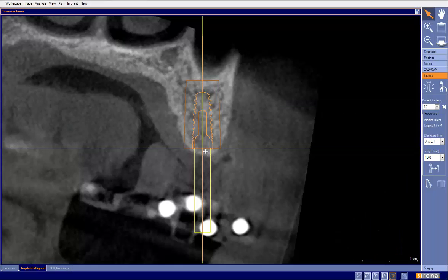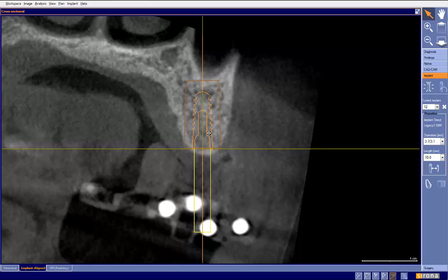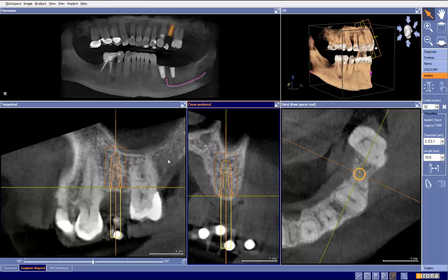Now the next thing is our bone level, and again a rounded bone. Maybe we could drop that to right there, but if you compare that to that, it's not that big of a deal. I would say bone-wise, this is fantastic from a bone level perspective. Vital structures, we do have to worry about the sinus here. Based on these images, we look to be avoiding the sinus. Now, remember what I always say.